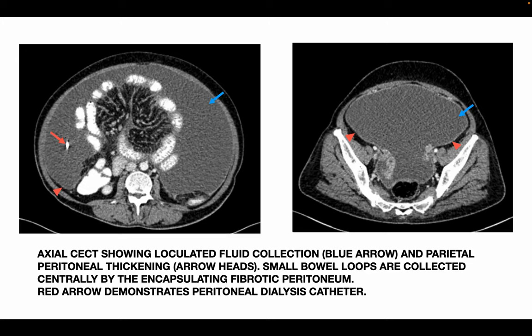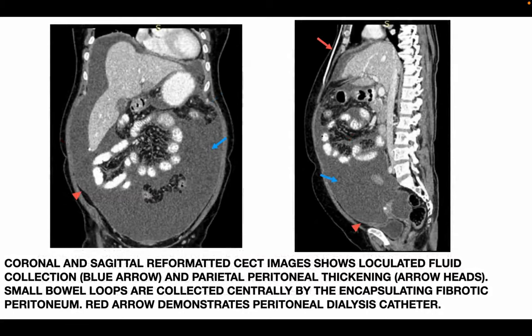This is a case of a 58-year-old female patient on long-term peritoneal dialysis who presented with abdominal pain and distension. Axial CCT shows loculated fluid collection (blue arrow), parietal peritoneal thickening (arrowhead), and small bowel loops collected centrally by the encapsulating fibrotic peritoneum; the red arrow demonstrates the peritoneal dialysis catheter. Coronal and sagittal reformatted images of the same patient confirm the loculated fluid collection, parietal peritoneal thickening, and centrally collected bowel loops.